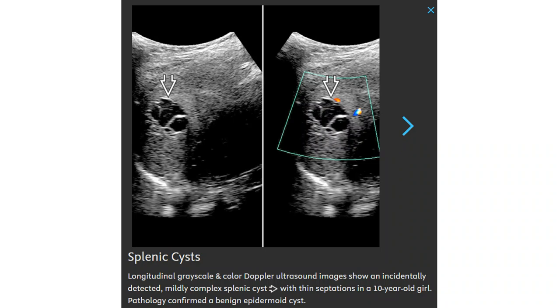This is a grayscale and color Doppler ultrasound image showing an incidentally detected, mildly complex splenic cyst seen incidentally in a 10-year-old girl. Pathology confirmed a benign epidermoid cyst.